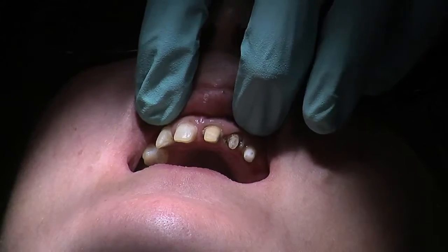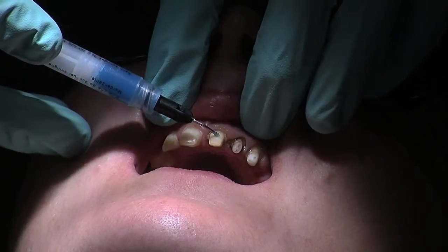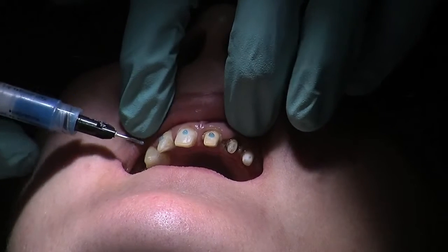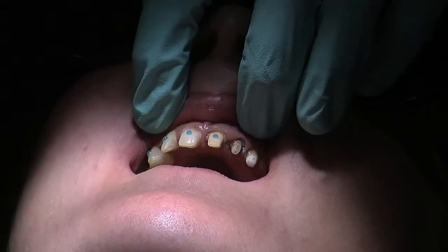We're now going to make the trial smile. We've got Luxatemp B1 that we're using. So what I'm going to do is spot etch just certain of the teeth where I did the veneers. A little bit of acid etch right in the middle of each tooth. In this particular case, I think these 4 would be sufficient. The rest of the teeth are root filled.